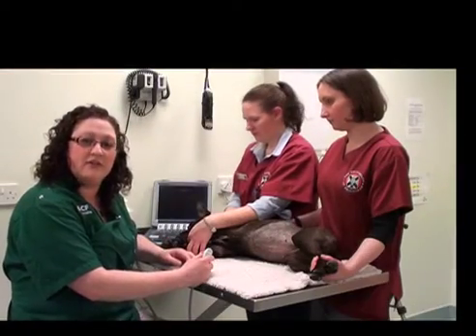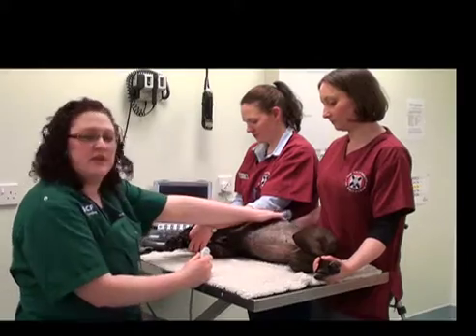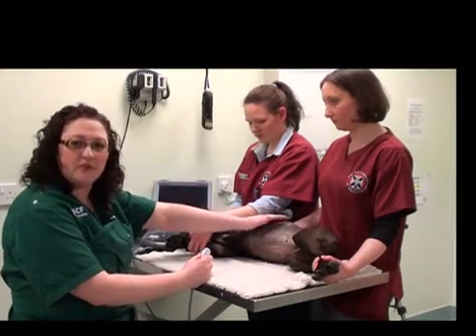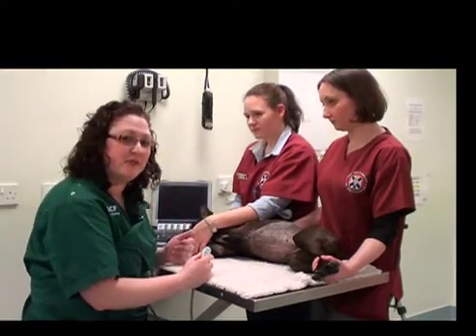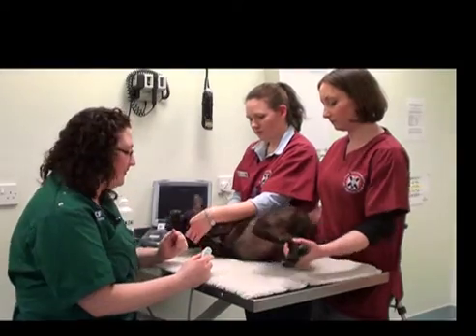Now we'll proceed on to the spleen. The way we'll do this is we'll start off by finding an organ that we know — we've just found the liver, so that's a good place to start.